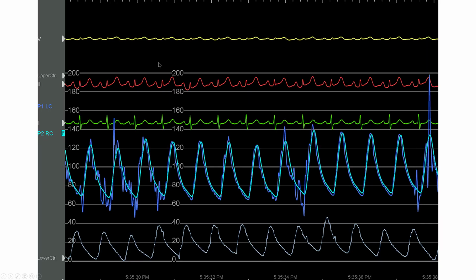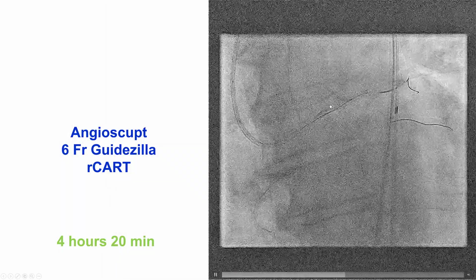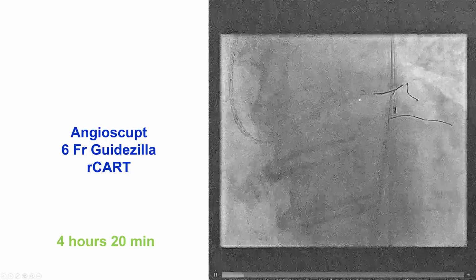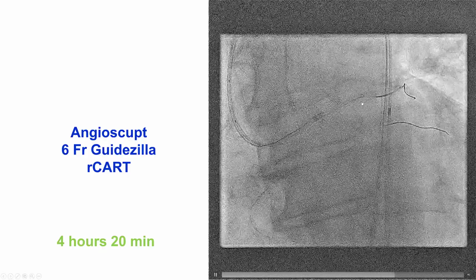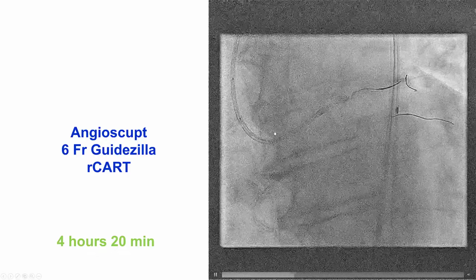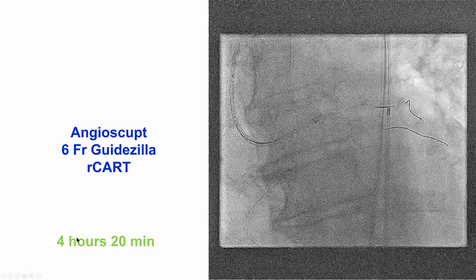At this point, the patient is doing okay. There's maybe some hint of ST elevation, but he was not having any chest discomfort, and his pressure was good. We re-engaged, and we were able to rewire into the LAD. We used the 6 French Guidezilla guide extension, and then we were able to do successful reverse CART. And now we have crossing of the lesion at 4 hours and 20 minutes after the beginning of the procedure.